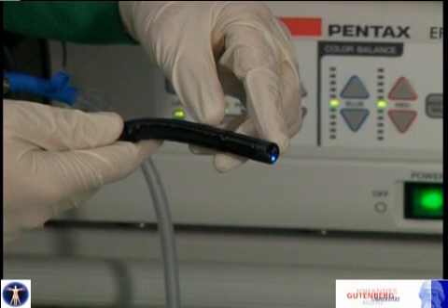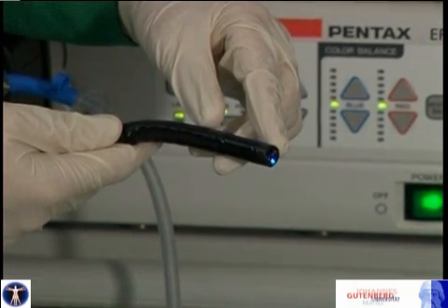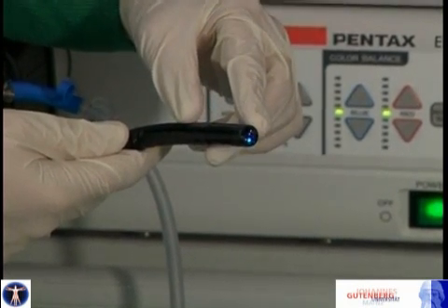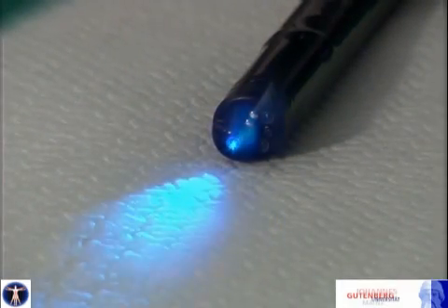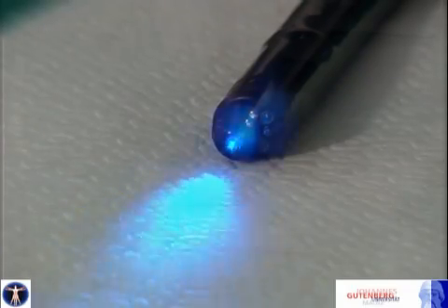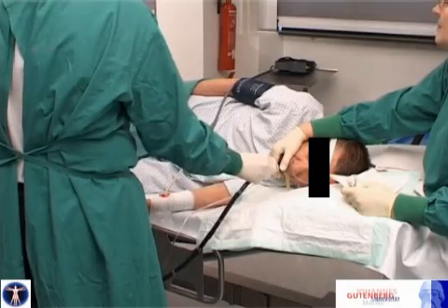Confocal laser endomicroscopy is a newly developed diagnostic tool enabling in vivo histology during ongoing endoscopy. Endomicroscopy becomes possible due to the integration of a miniaturized confocal microscope into the distal tip of a conventional endoscope. A blue laser light is emitted and analyzes mucosal surface architecture in the gut at high resolution.